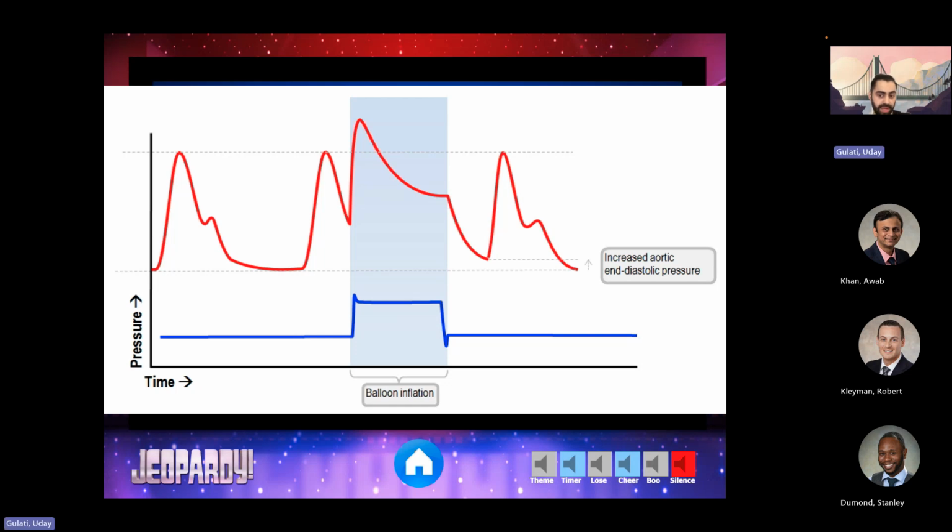Right. So really what you talked about is that the C waveform that you had is a lot wider than it should be. And that's because the balloon pump is staying open longer. And so that assisted increase in end diastolic pressure, like Jared just talked about, E is not lower than G.